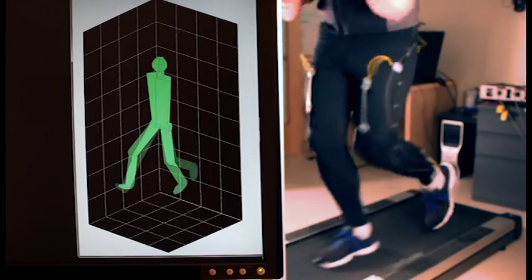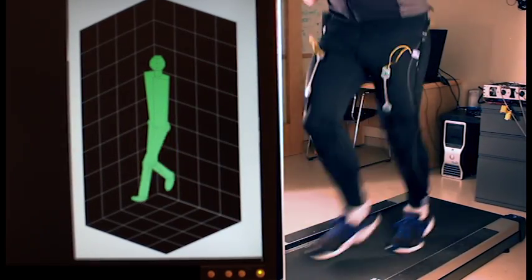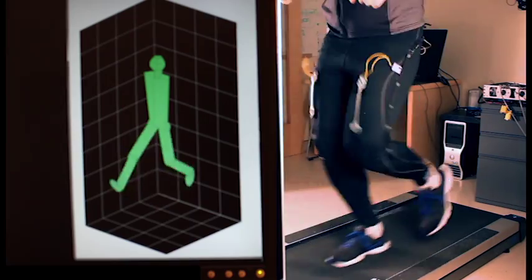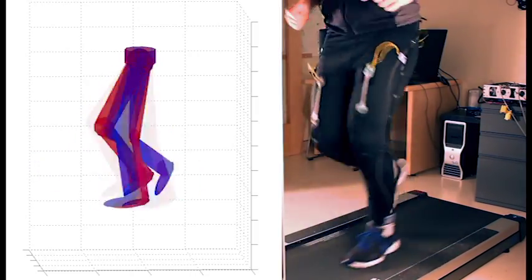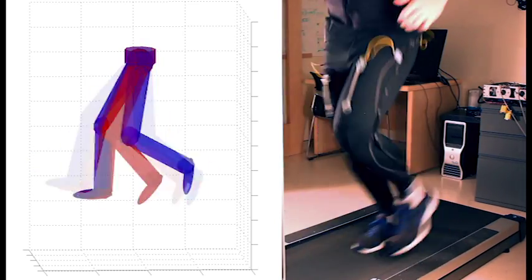The sensors have less than 5 degrees of error when walking and less than 15 degrees of error when running at 2.7 meters per second. Here we see that the soft sensor's output in red compares well to optical motion capture, ground truth in blue.